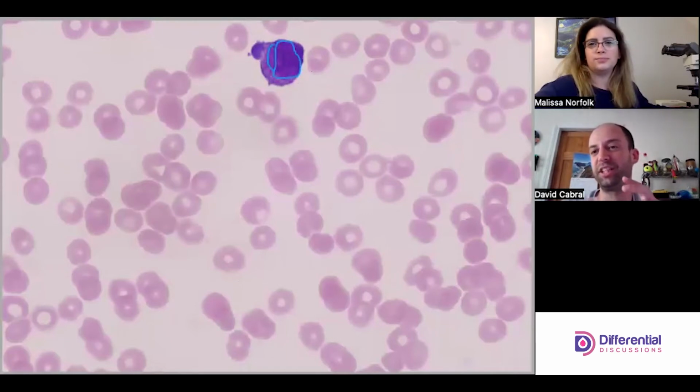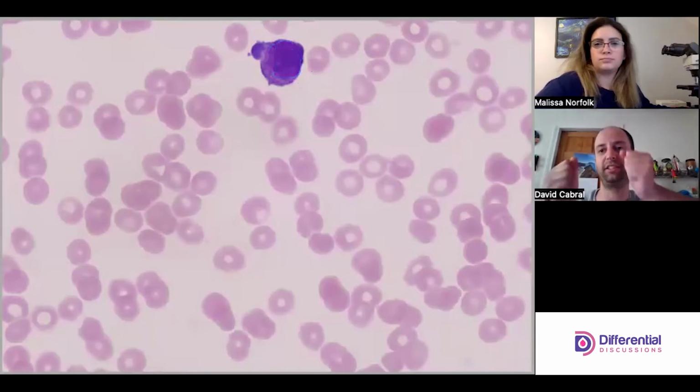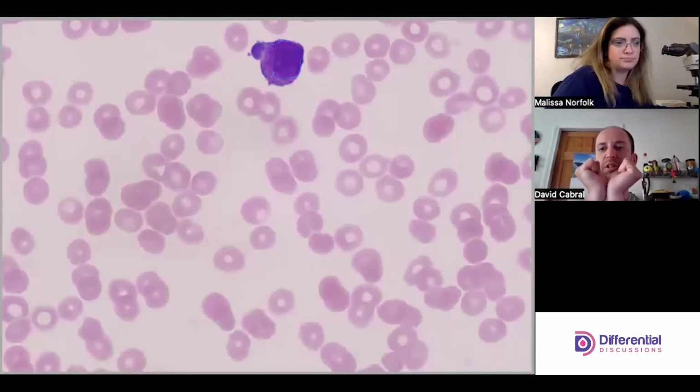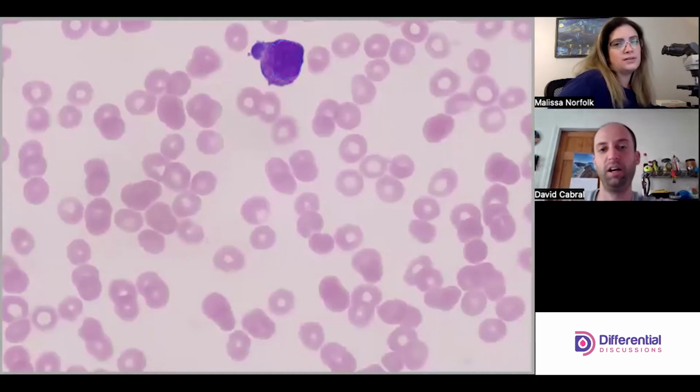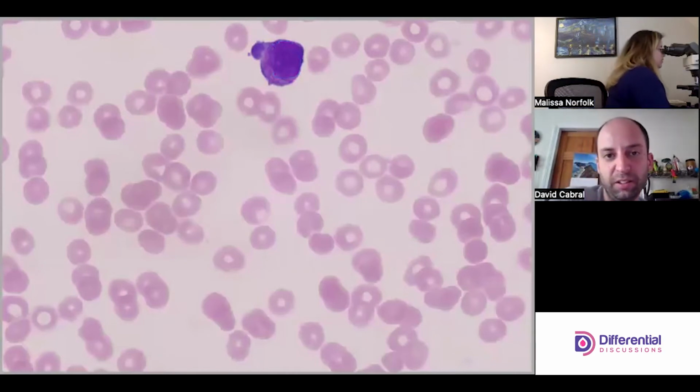So this is an interesting time to talk about, these are spheres essentially, right? And if you have two lobes, it's nice when you see it in that conformation, but say they're more like this, so you might subtly see that lobe on the bottom just peeking out on the side. It comes with experience and looking at these things.